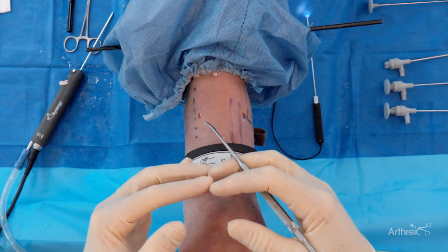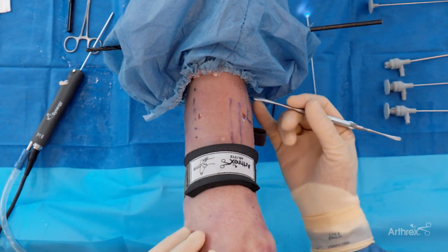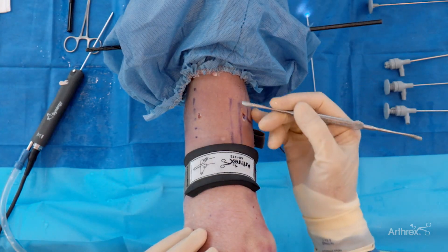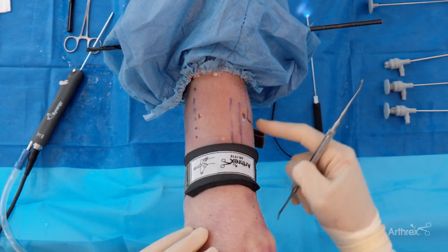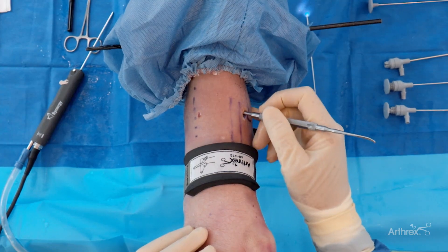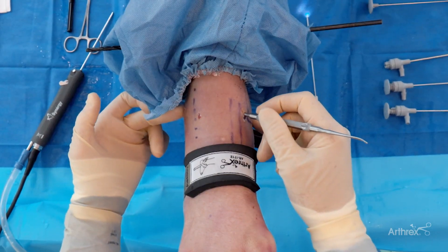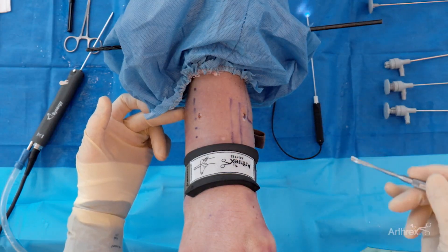If I'm doing an ankle stabilization and I want to scope — we'll use that as a situation today — I do always outline the medial malleolus, the inferior border here. This is the tibialis anterior tendon. You can feel the edge, kind of that medial edge, and about a finger width up, I make a medial anteromedial portal, angling back into the joint here. It's a nice safe spot, angling towards the fibula as I insert instruments to establish that first portal. I always start on the anteromedial.